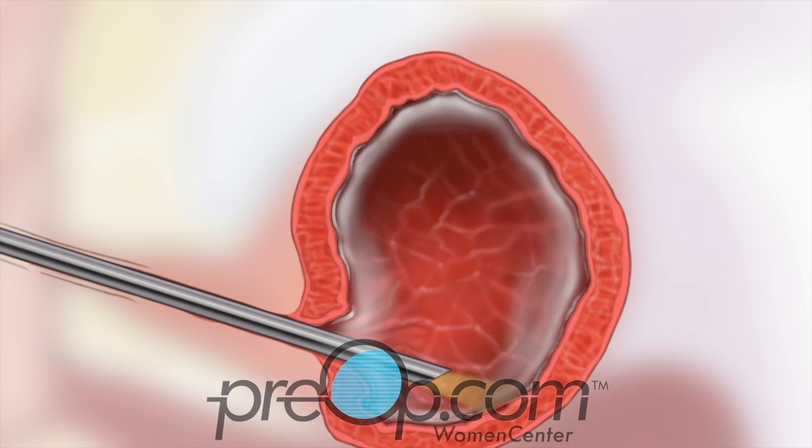After the surgeon makes a final inspection of the bladder, the scope is removed.